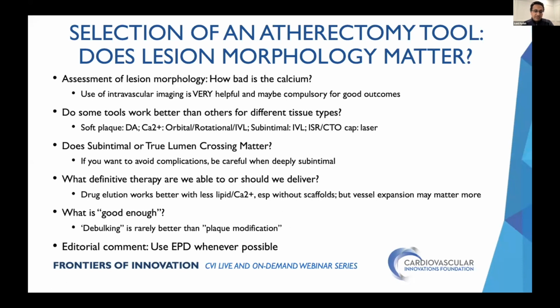And my editorial comment for all of these cases is that whenever I'm using atherectomy, almost 100% of the time, I use an embolic protection device. It makes for a very long and bad day, even in those infrequent cases when you have embolization. And so I just like to use it prophylactically. Thanks very much.